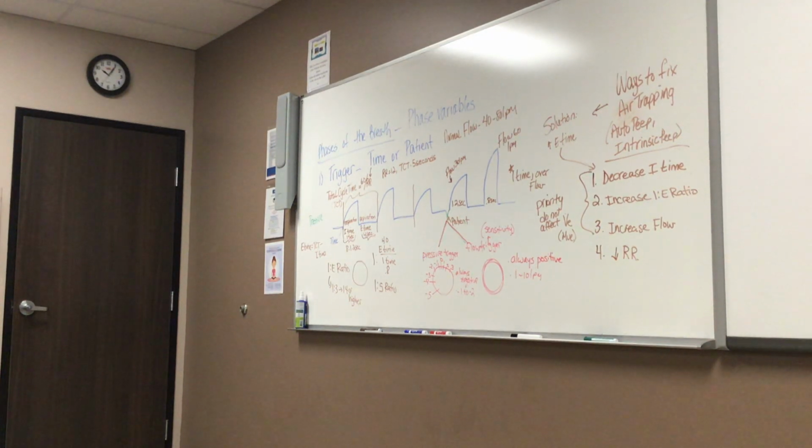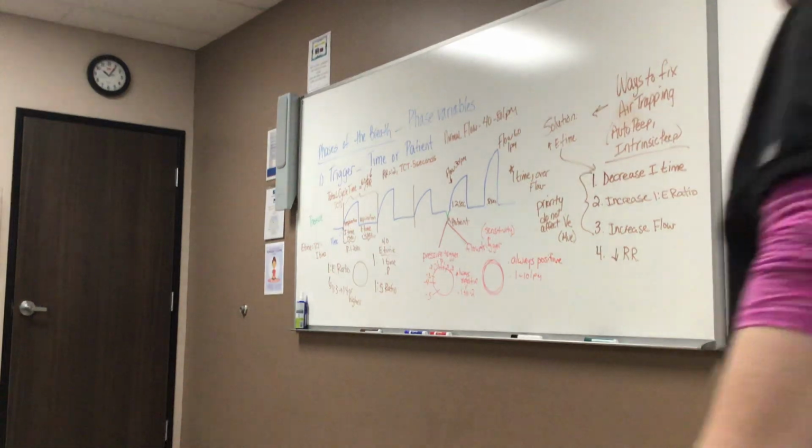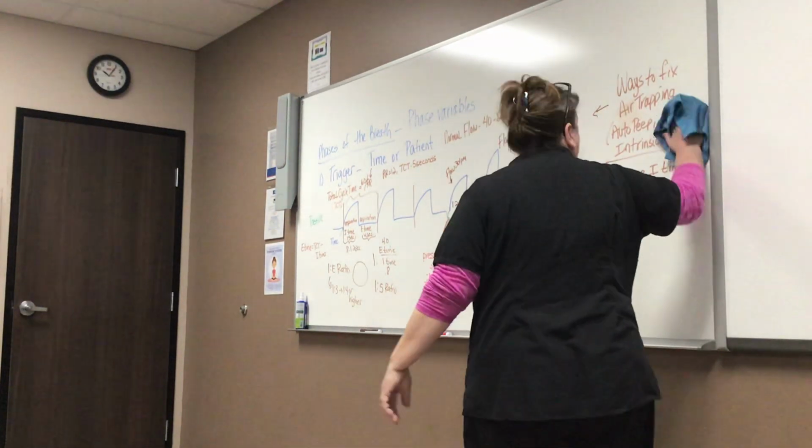Bias flows between two, and it senses the displacement flow, and it's just on and breathing. Yeah. Okay.